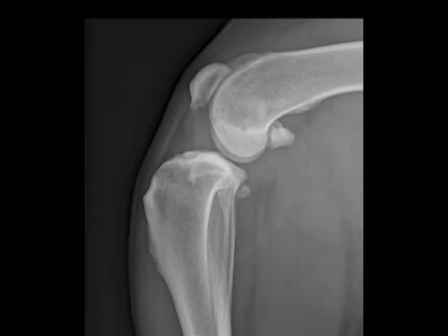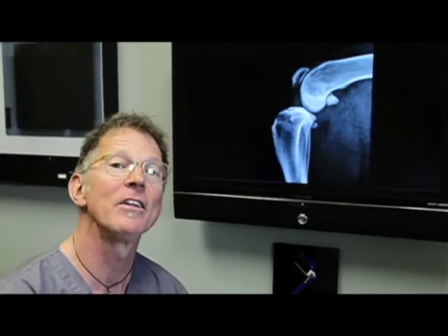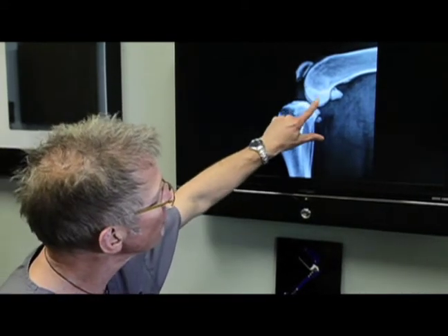and/or scar tissue within the joint that shows up as a gray mass effect. We also see bone spurs on the end of the patella — very commonly those bone spurs are not causing a problem, but they're a sign that the joint is chronically inflamed. 99% of chronically inflamed canine stifle joints have ACL disease. We also see that the femur has slid back on the tibial plateau.